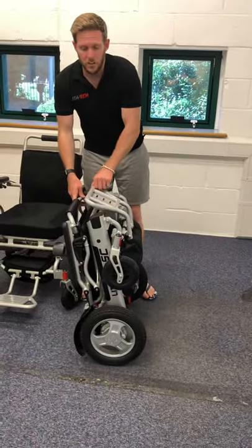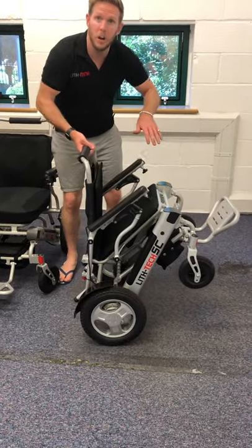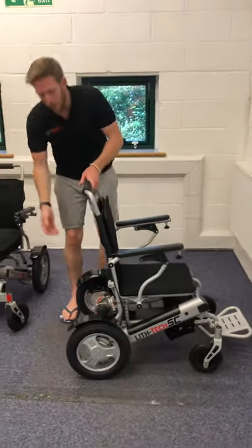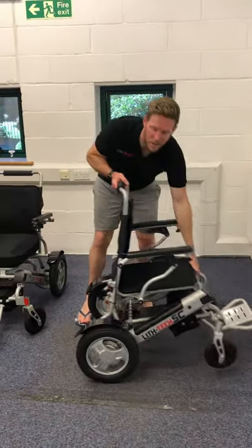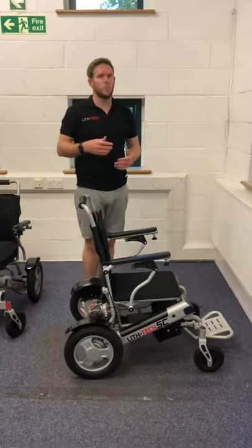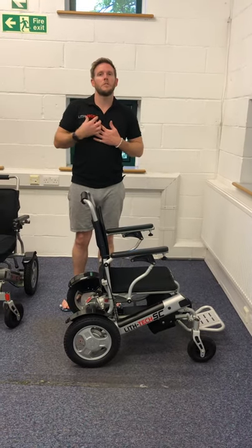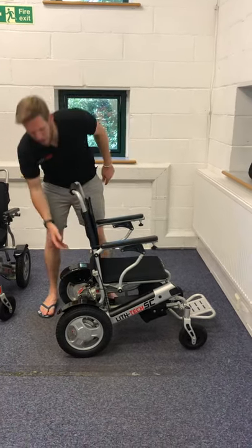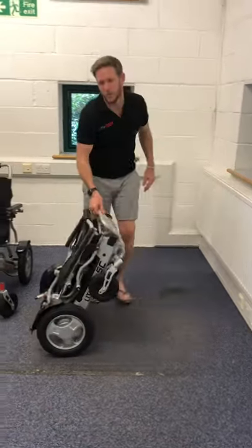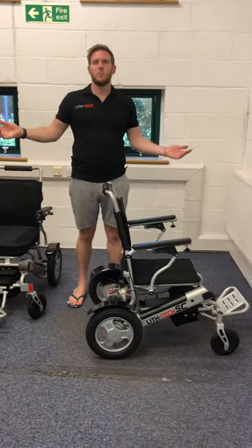To unfold, push the footplate away, lean the chair forward so gravity helps it open, and give it a helping hand pushing it down. Alternatively — and this is even easier — you can stand behind it or to the side and flick it out like a pushchair. It really is one to two second folding and unfolding. Even with one arm I can still fold this chair — one hand all the way down to the floor, then unfold with one hand. That's literally a piece of cake.